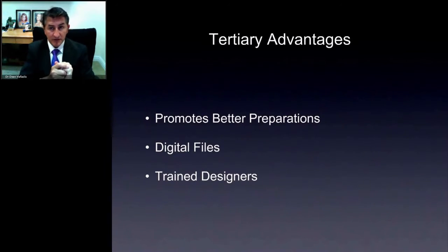You're cleaner, and your feel is easier. If you have a lot of blood in the area, then you have to step back and not take that impression. So that controls the scanning ability. You don't want to have an area with a lot of blood or fluid. That forces you to clean up the site and wait for the perfect impression, instead of using an Impergum type of polyvinyl siloxane and trying to get that margin. This makes sure that you're going to get a beautiful impression each time.